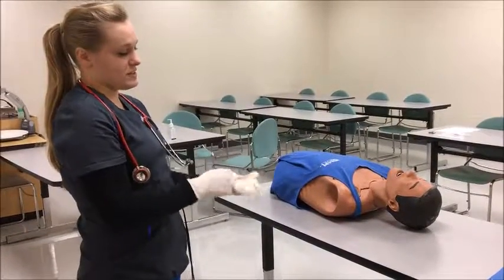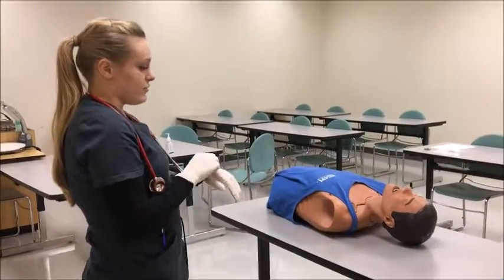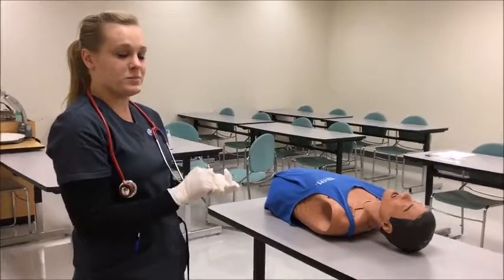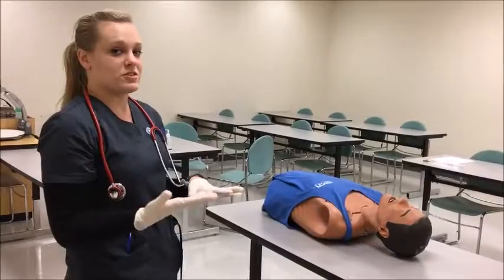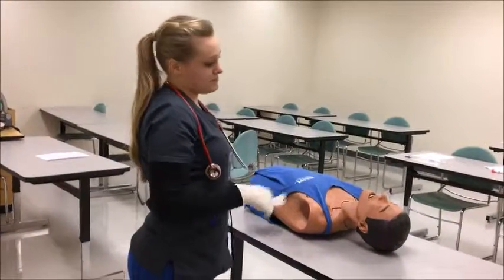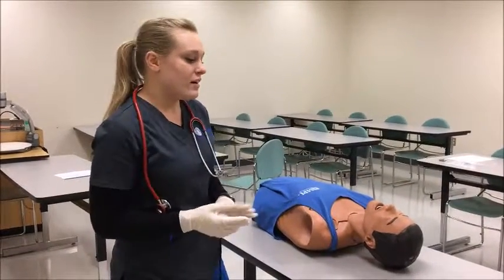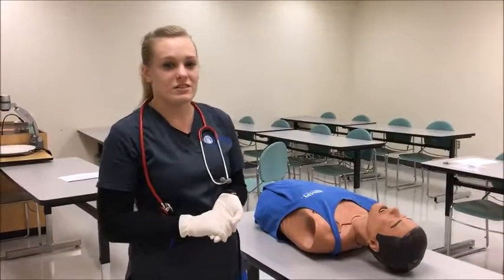The certain risks and precautions with this procedure would be you would have a level of soreness or dryness with the air. And safety precautions would be to stay away from flammable items because the oxygen could combust. Do you have any questions, Mr. Smith? No? Okay. The indications for oxygen therapy are low sats and low oxygen tension.